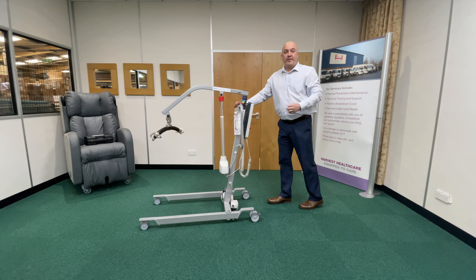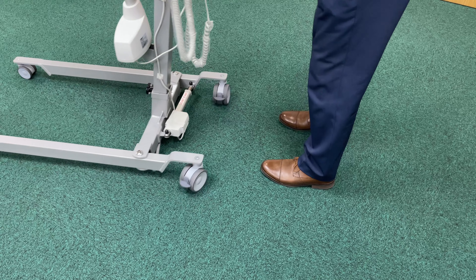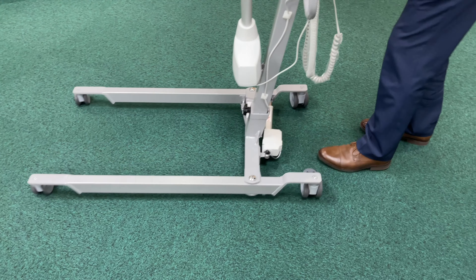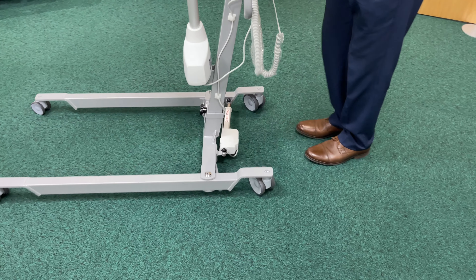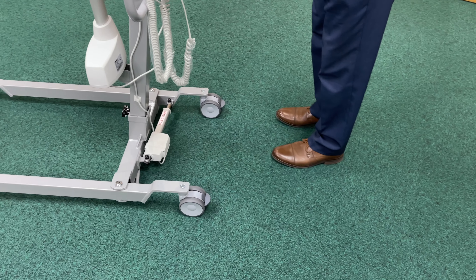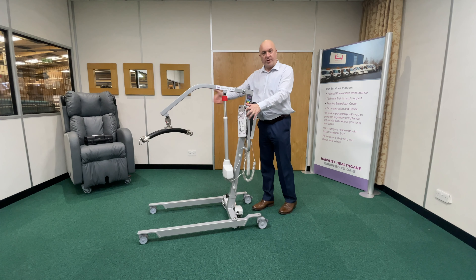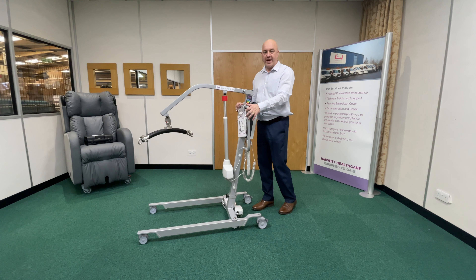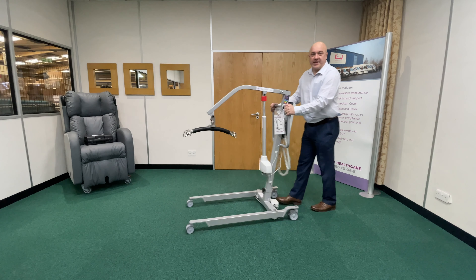It also works when you're just generally moving around the room. So if I'm moving forwards and want to stop and go backwards — don't. Instead, go sideways and backwards, then sideways and forwards, sideways and backwards, sideways and forwards — and I can do this all day long. The carry bar doesn't swing, the person doesn't swing, they don't bang themselves around, because we're avoiding that twisting of the casters into the carpet which causes the swing, the pause, and the effort from staff.